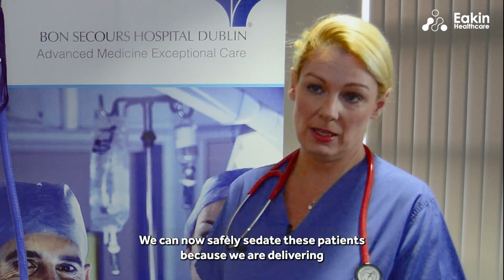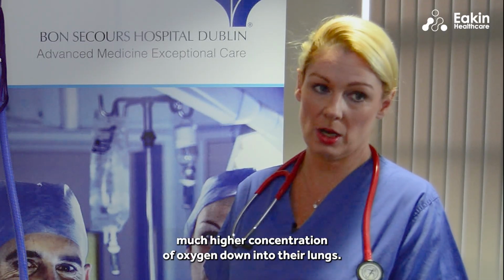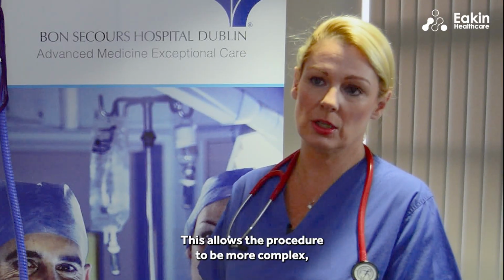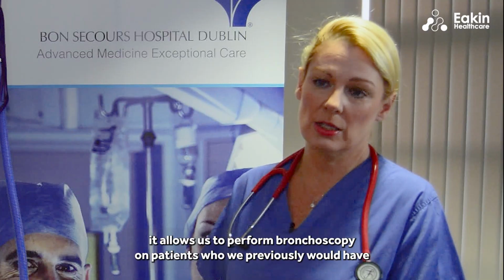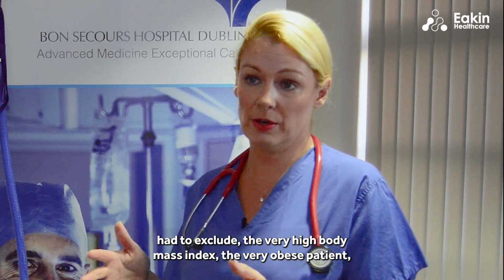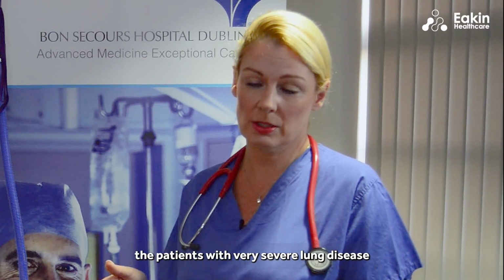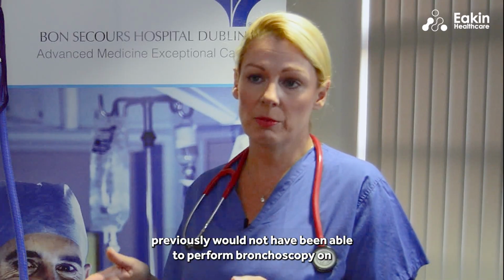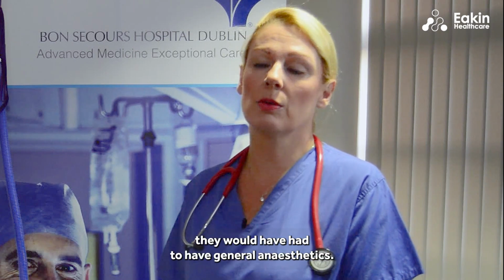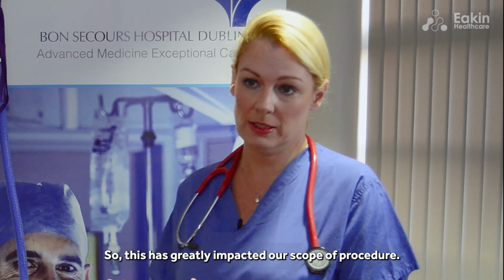We can now safely sedate these patients because we are delivering much higher concentration of oxygen down into their lungs. It allows the procedure to be more complex. It allows us to perform bronchoscopy on patients who we previously would have had to exclude, the very high body mass index, the very obese patient, the patients with very severe lung disease. Previously, we would not have been able to perform bronchoscopies on these patients. They would have had to go to the operation theatre. They would have had to have general anaesthetics. So this has greatly impacted our scope of procedure.